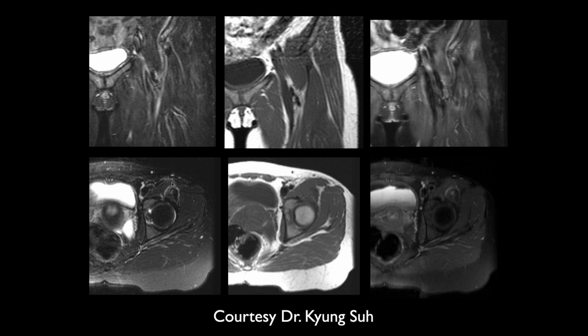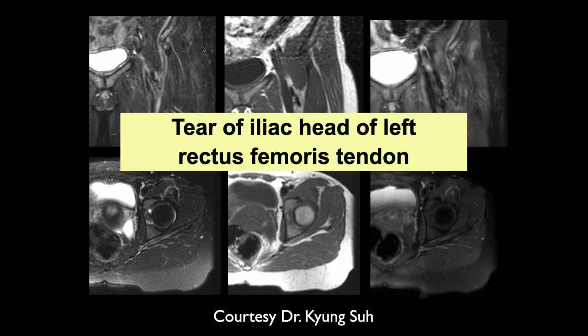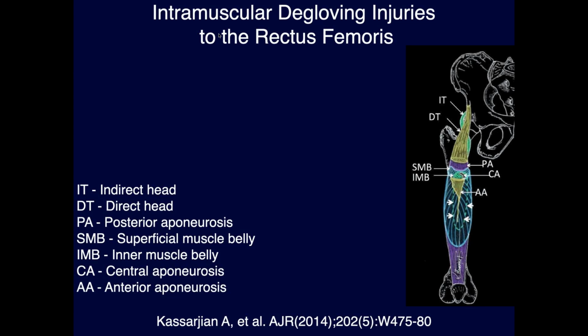And now it looks like there's quite a bit of signal heterogeneity within the rectus muscle, and there's edema at the anterior inferior iliac spine. I don't know if there's any intact fibers. Crutches.